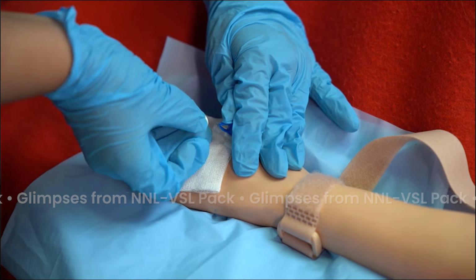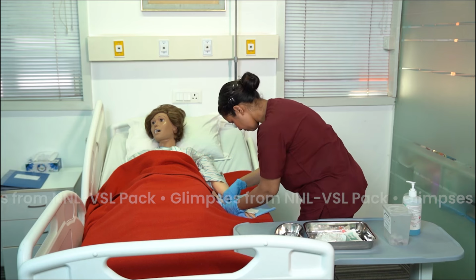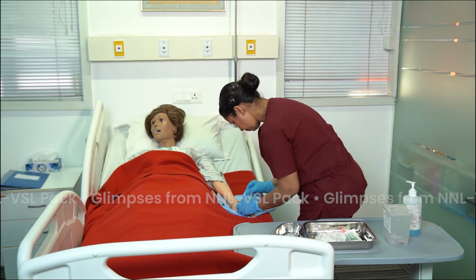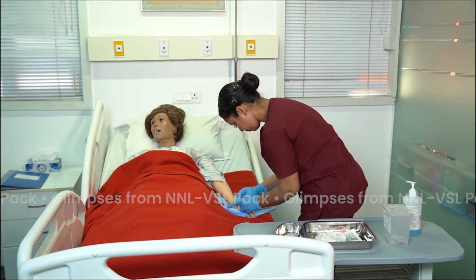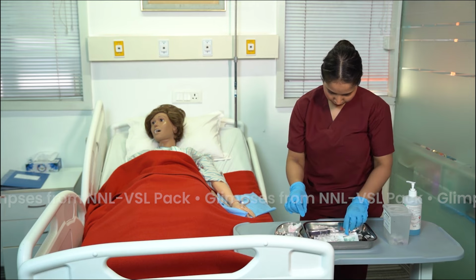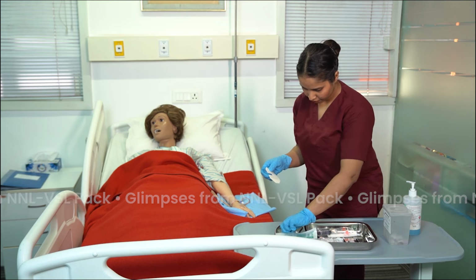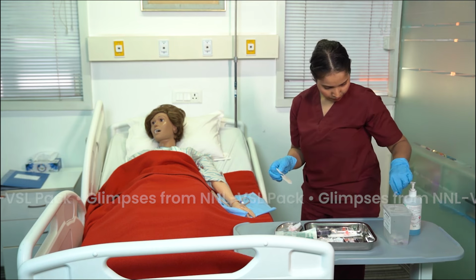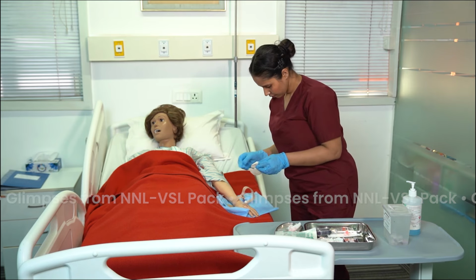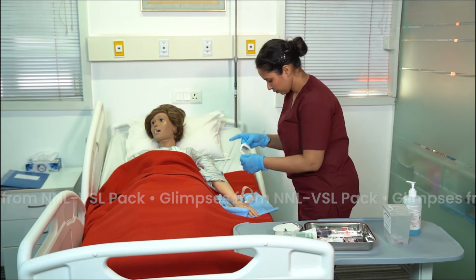Attach the white lock cap. And secure the cannula with an appropriate dressing.